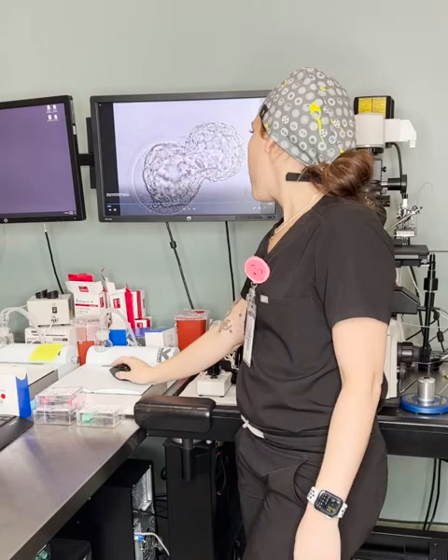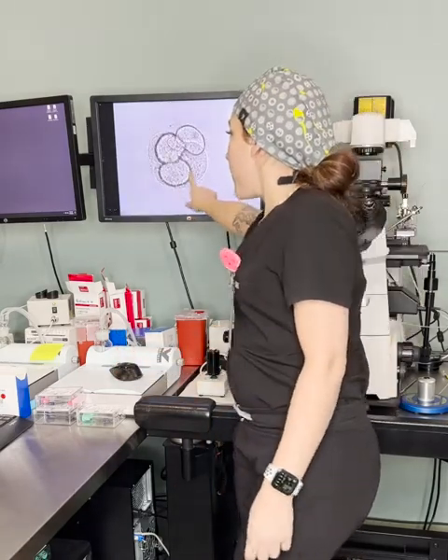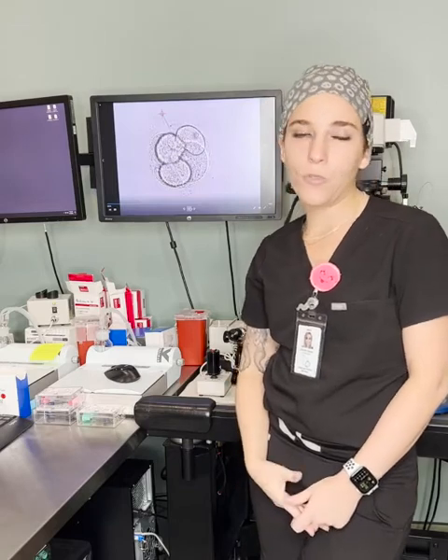Let's move on to the next one, which is going to be our day 3 hatching. So, as you can see, here are the blastomeres, also known as the cells. If you get a day 3 report from your doctor, you get a cell number and a grade for each embryo on day 3. Lots of doctors have stopped doing this because they feel that day 3 information is really not important unless it's a 1 cell, 2 cell, 3 cell embryo. Anything 6 cells and up, and honestly I've even seen 5 cells catch up, they don't feel that information is very valuable.